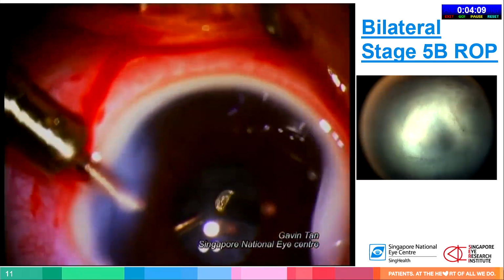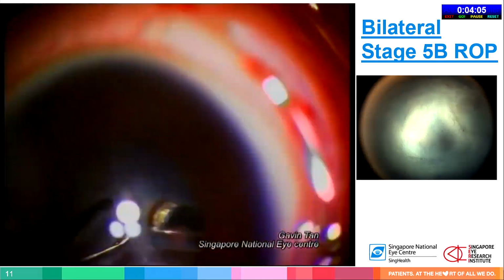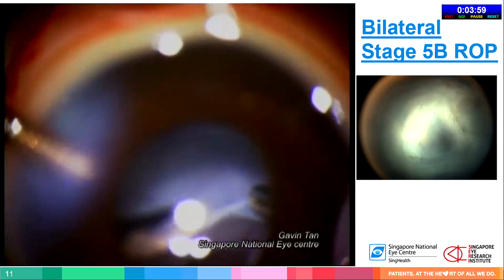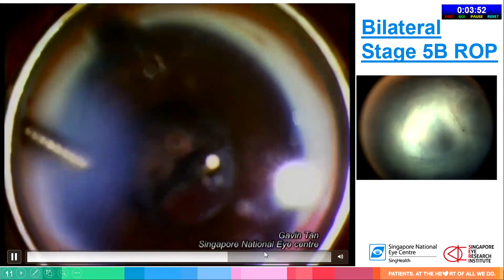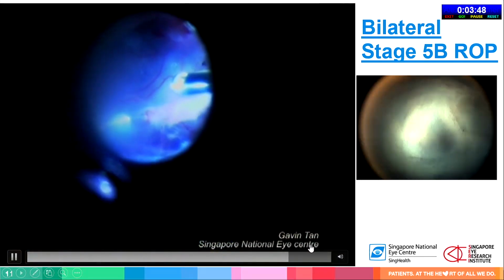You may start off with just filling the anterior chamber, and the anterior part of the eye, with viscoelastic to keep it stable while you create an opening in that hyaloid membrane and then slowly dissect the tissue away. You often will not end up with a flat retina at the end of the surgery. It does not matter, as long as you're quite confident you've relieved most of the traction, as you can see in this case.